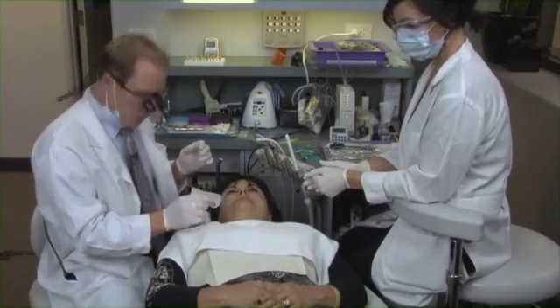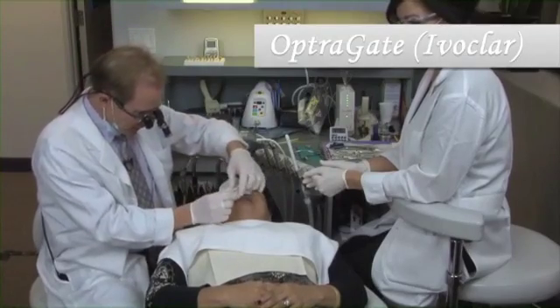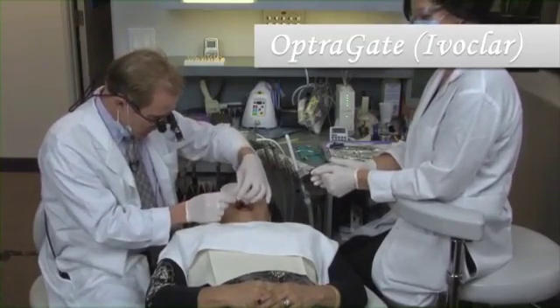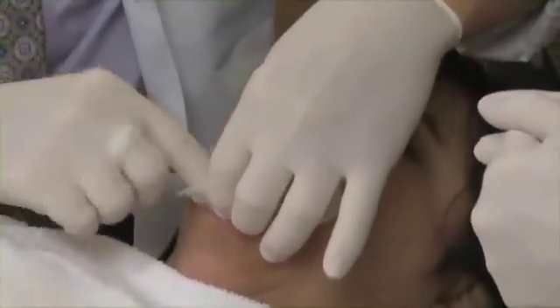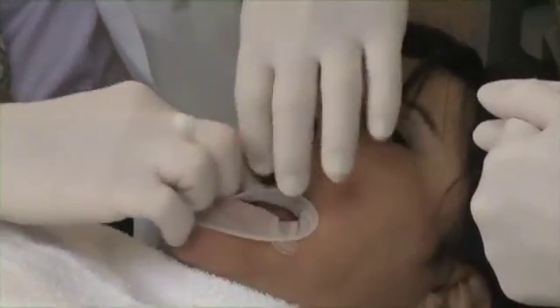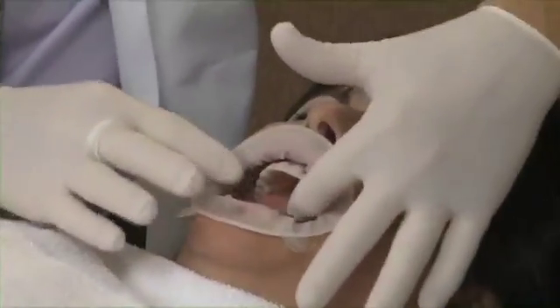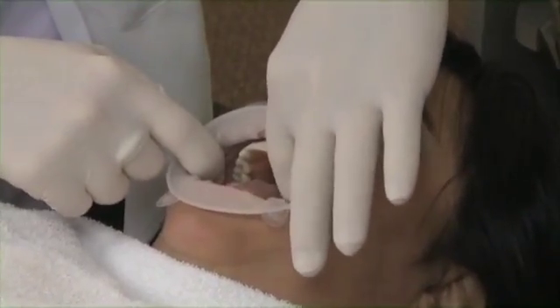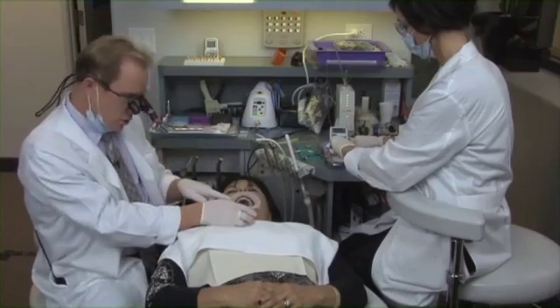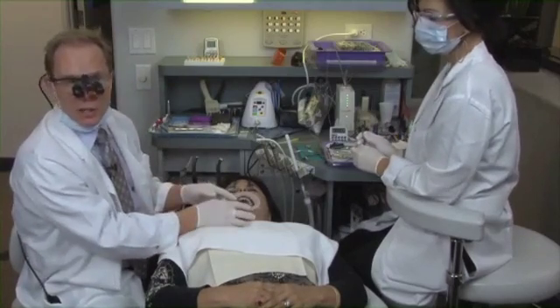There are lots of different cheek retractors out there on the market. This is an OptraGate from Ivoclar. For me, it's very comfortable for the patient. It's a non-latex silicone material with a stiff inner rim ring and a stiff outer ring. We also use this when we take our impressions — you can see how it basically pulls the cheeks away from the vestibule. We can also use it during our equilibration, especially if we use a horseshoe type articulating paper.